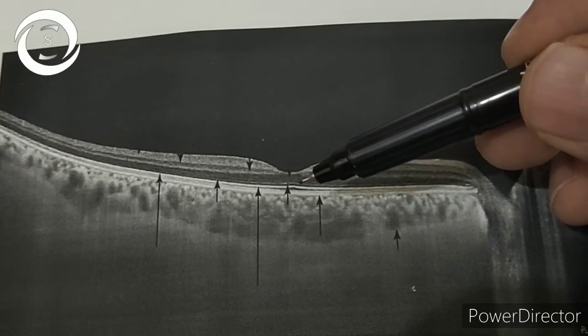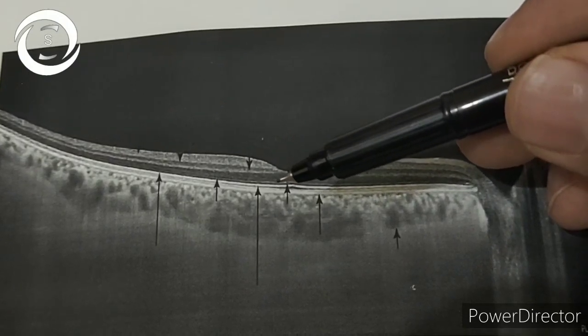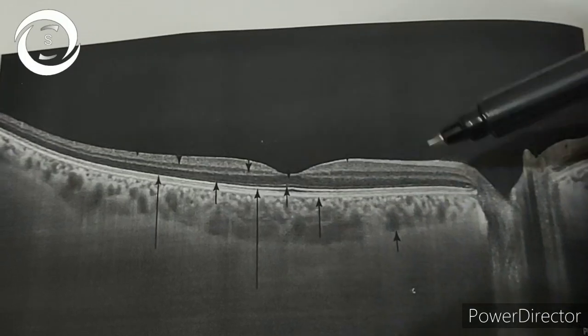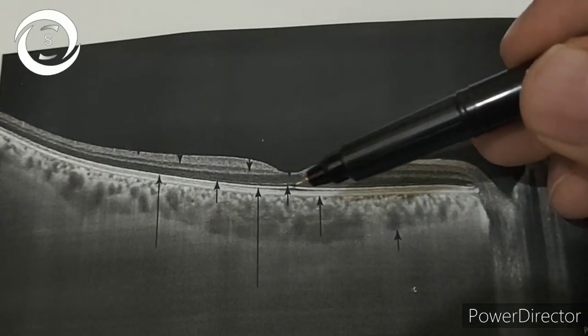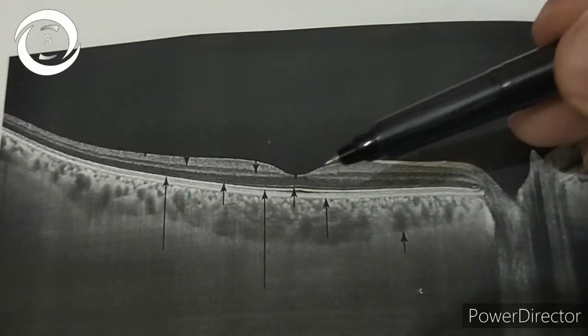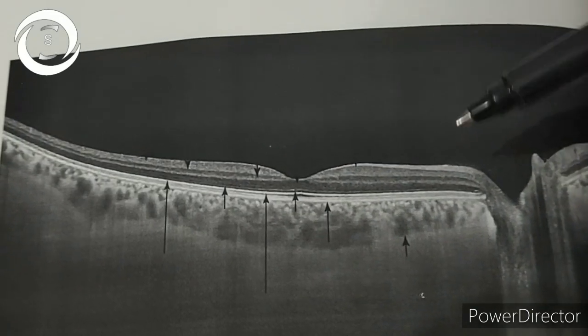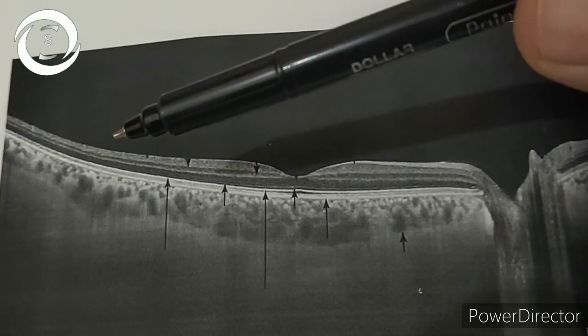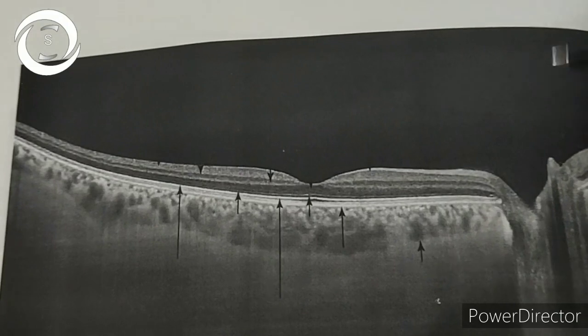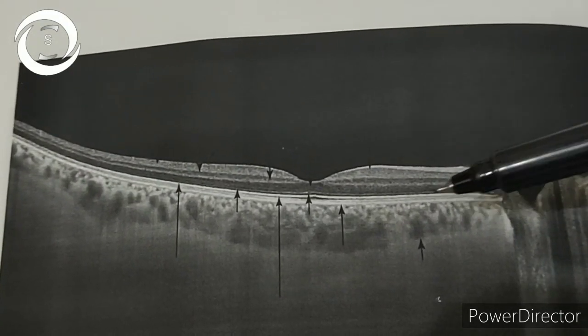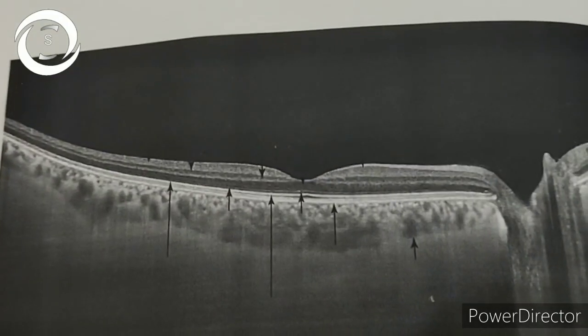At the fovea, these above-mentioned layers are absent and the outer nuclear layer is only present as a hypo-reflective layer, but thickest here as compared to the periphery. Beneath it is a very thin hyper-reflective line.